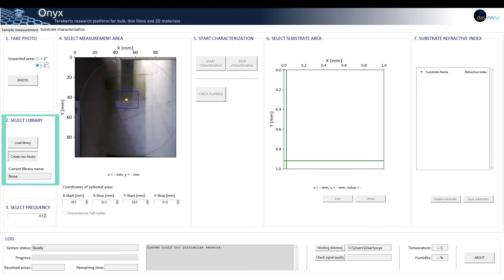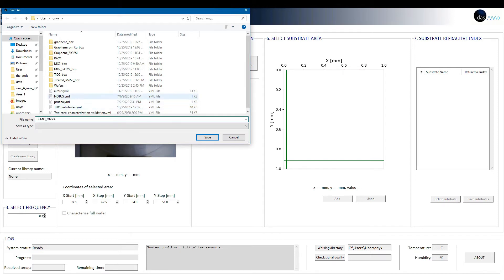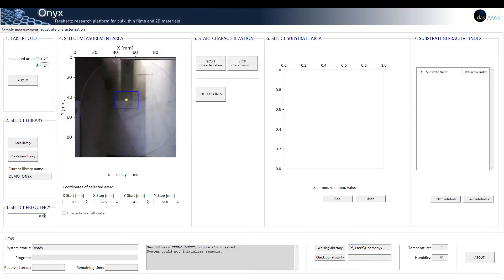Two: select library. The user can create its own substrate library and also load pre-saved substrates by just clicking load library. Three: select frequency. The frequency of the emitted signal can also be selected.